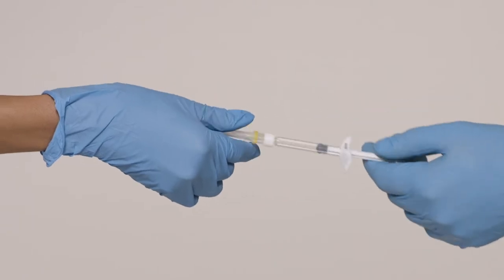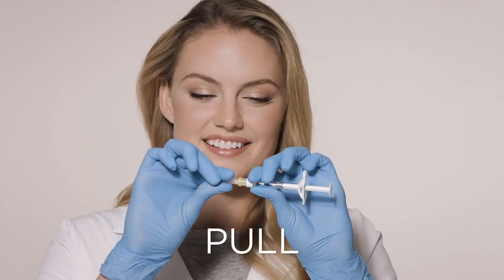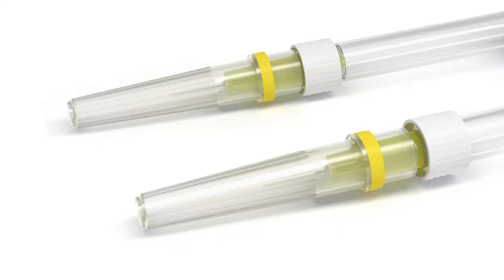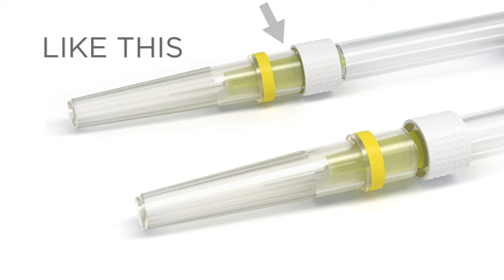And finally, while still holding the luer lock adapter and syringe in one hand, hold the needle shield with the other and pull straight out. When you're done, your syringe should look like this — not this.